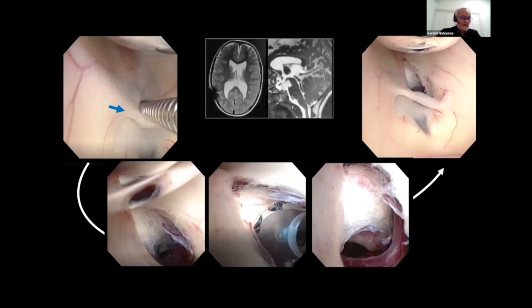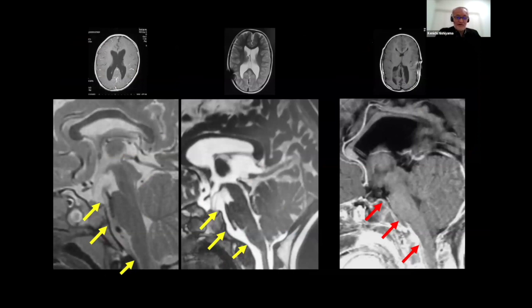So in Chiari, careful passage of the narrow foramen of Monro, perforation of the transverse fold of the third ventricular floor, and then complete fenestration of the thickened trabeculae and the cistern. These techniques are required for complete CSF diversion for shunt removal. So considering this effect of ETV, enough CSF space in the cistern before the brainstem and foramen magnum will be required. So Chiari with a tight posterior fossa is sometimes a contraindication for me, since CSF pulsation could not be buffered in the cistern.